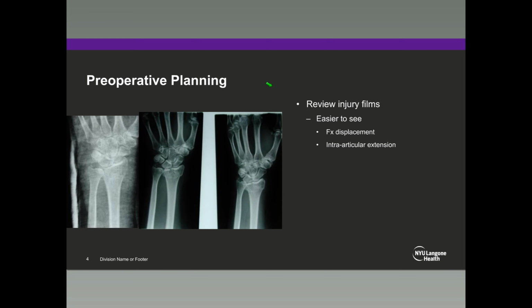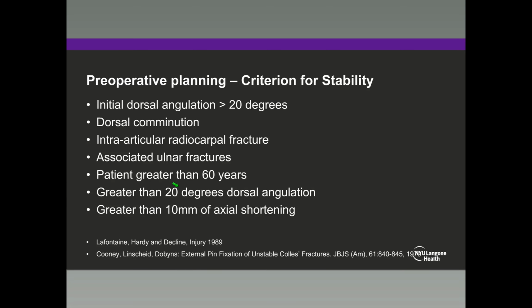For example, in this case, if I were to bring my arrow into the field, in our splinting x-ray, it looks like there is no fracture. At best, it looks like maybe there's an extra-articular fracture, something that I can readily treat non-operatively. However, when I look at my injury films, I can see very clearly an intra-articular fracture with a very large lunate facet fragment. And as Omri pointed out, this is one of the markers of intra-articular extension, and a lunate facet fragment leads to instability.